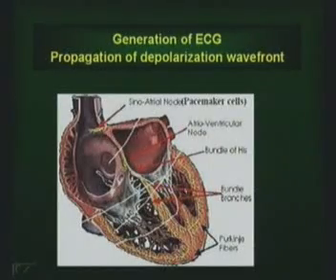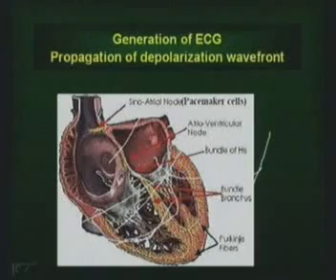If you look at the ventricular complexes, the heart is now situated in this direction, so the whole depolarization is reversed. When you record on the lateral side, you will see a gradual diminution of the voltages as you go from V1 to V6. On the other hand, if you record ECG from right-sided leads, there will be a gradual increase in the voltages and it will mimic the same ECG as in a normal heart. So that means our V1 to V6 will be similar to the normal V1 to V6 of a normal heart. That's in brief.